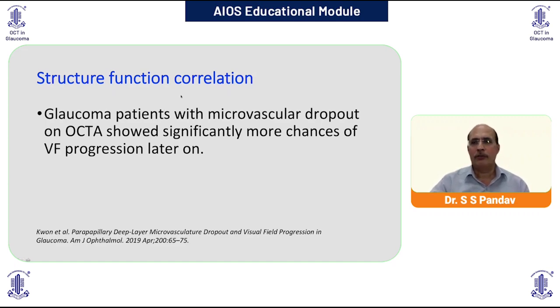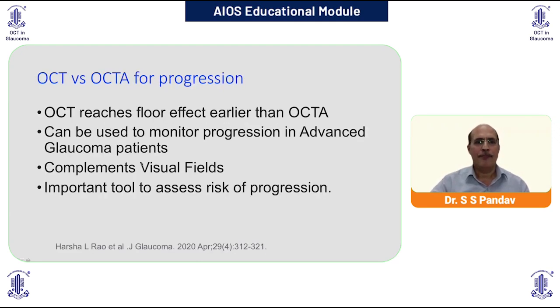So OCTA changes can also predict or point to the risk of finding changes on functional testing as well. So again, this points toward the utility of OCTA in glaucoma.